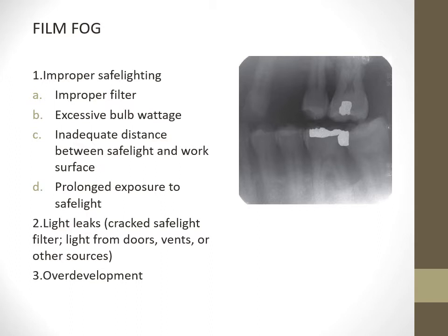I told you light leak could be due to a cracked safe light filter. There could be a crack in the safe light filter. There could be light from doors. There could be light from ventilators or other sources. Any light leak can cause film fog. Overdevelopment also causes film fog. This is a radiograph which is faulty. It is a film fog.